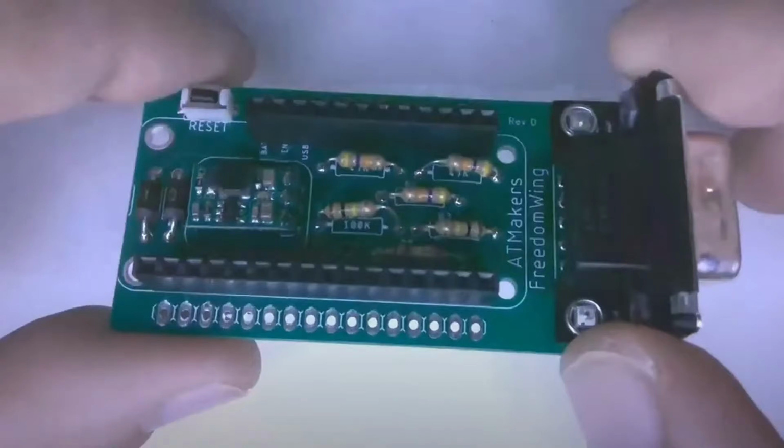This is a Freedom Wing. It's a circuit board that attaches to an Adafruit Feather microprocessor, and it allows you to connect your wheelchair joystick using a standard DB9 connector into the device and then read the analog outputs from the joystick to control a variety of devices. It was originally designed for use with the Xbox adaptive controller, but we've adapted it to many other projects as well. I'm using it to control the mouse on my computer.